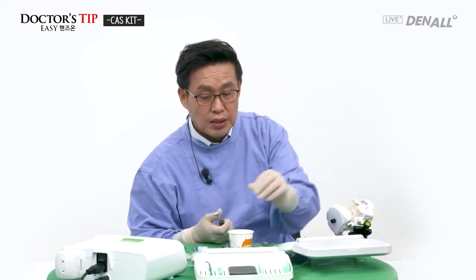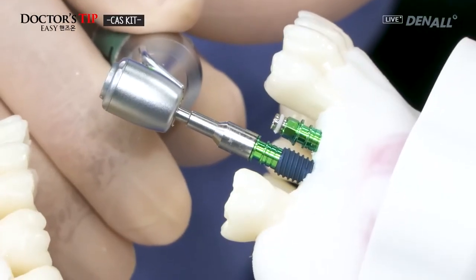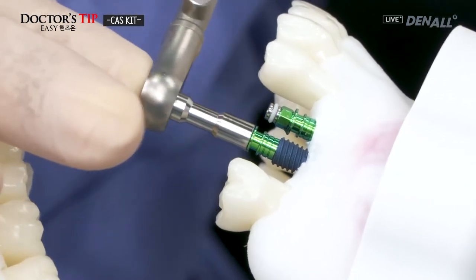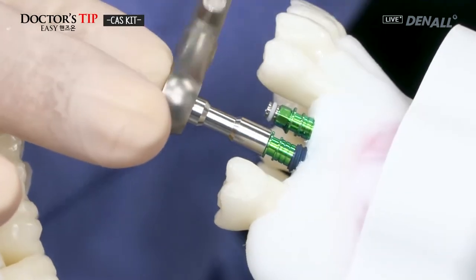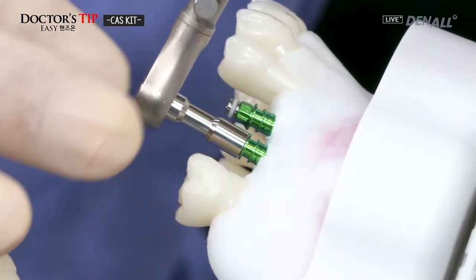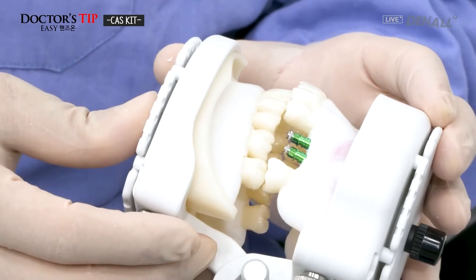Now, a 5.0 by 10 millimeter fixture is placed. The bone is very hard because it's a model. Now the implant will be placed at the final stage with the wrench. The stability is good enough. 1 millimeter under drilled. The fixture is placed. Relation with the opposing teeth, they are properly placed as we wanted.